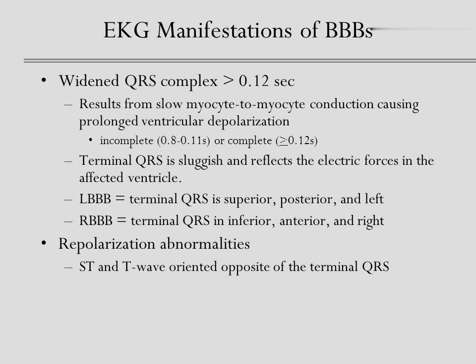LBBB equals terminal QRS is superior, posterior, and left. RBBB equals terminal QRS is inferior, anterior, and right. Repolarization abnormalities: ST and T wave oriented opposite of the terminal QRS.